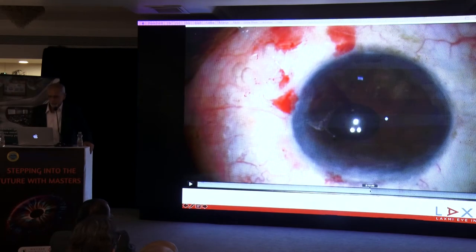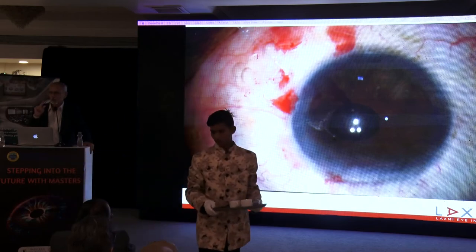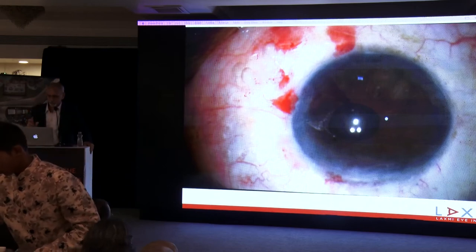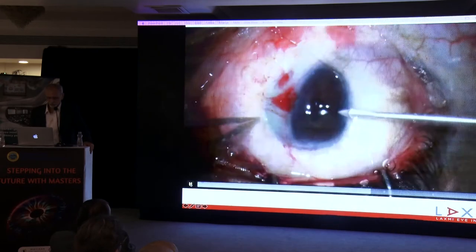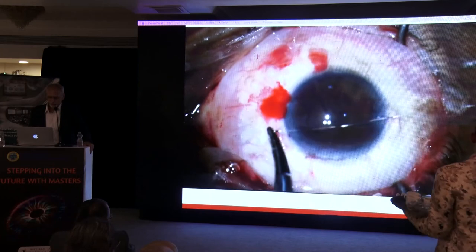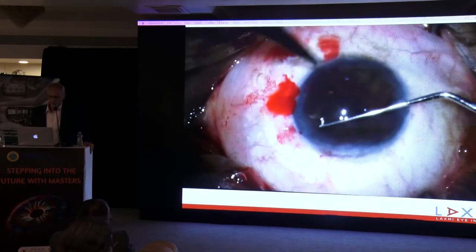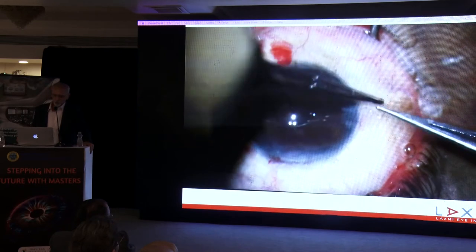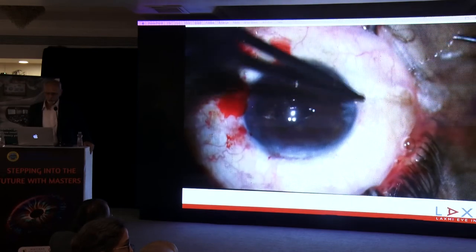So once I have covered that defect, now the lens position is below where it ideally should be, and that can be very nasty because your optic edge will always be exposed whenever the pupil dilates, and that can give you a lot of problems. So you have to do a second pupilloplasty to cover that 12 o'clock defect. So I go with a needle which is slightly bent and try and cover it in the upper part. And with a Lester hook, you try and pull that loop and create four throws through that, and just pull it, and then use your micro scissors through the main opening to cut it.